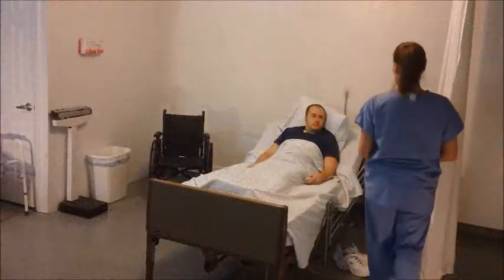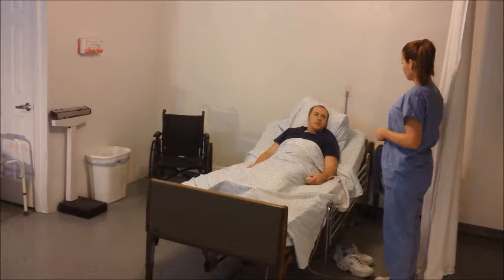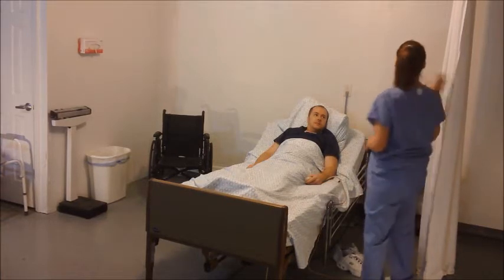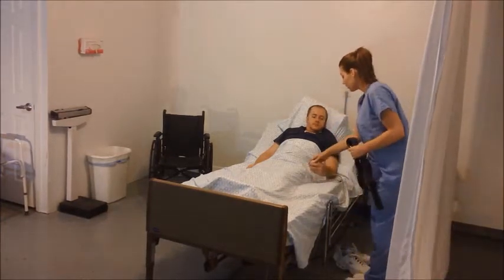Greet the client, address them by name, and introduce yourself. Explain the procedure by speaking clearly, slowly, and directly, maintaining face-to-face contact whenever possible, and ask client about personal preferences. Provide privacy with a curtain, screen, or door.